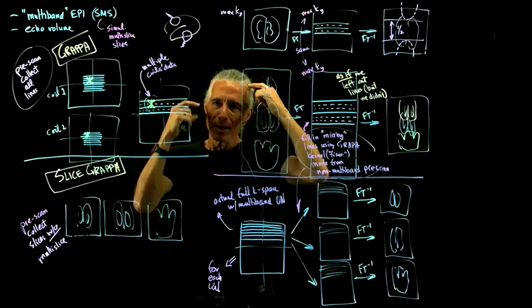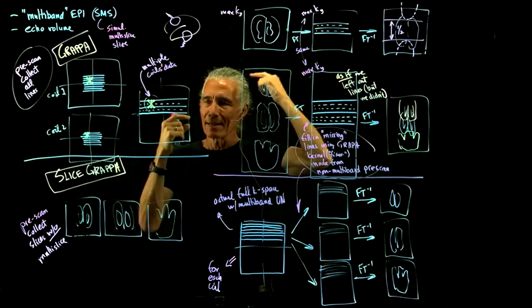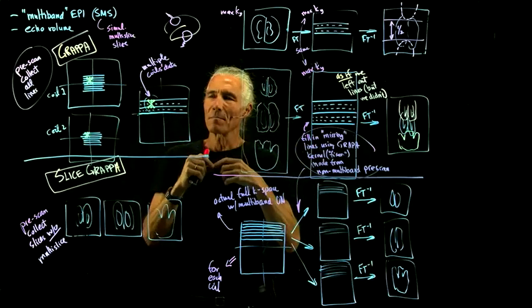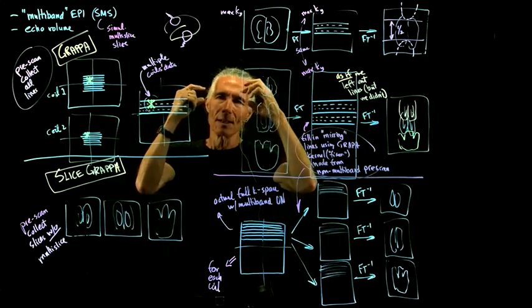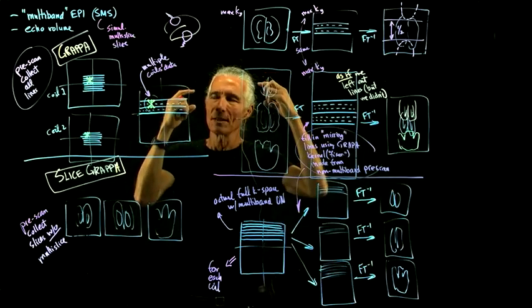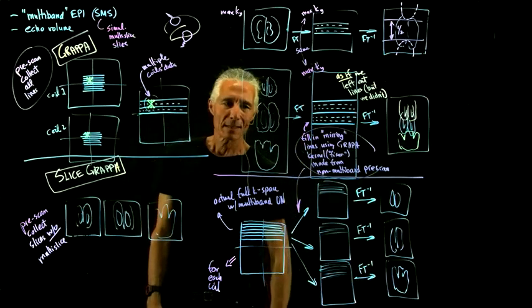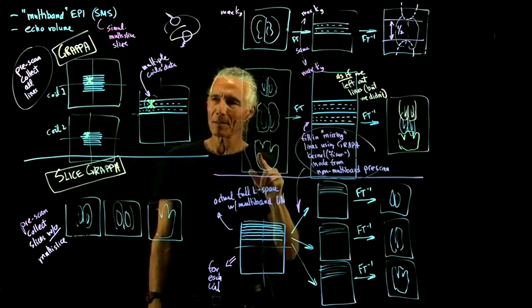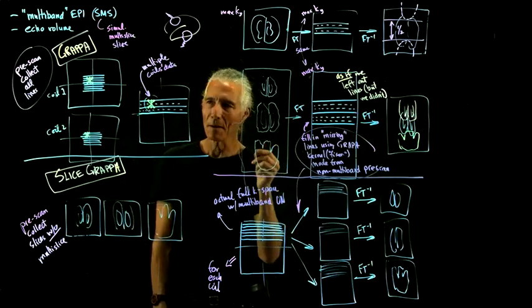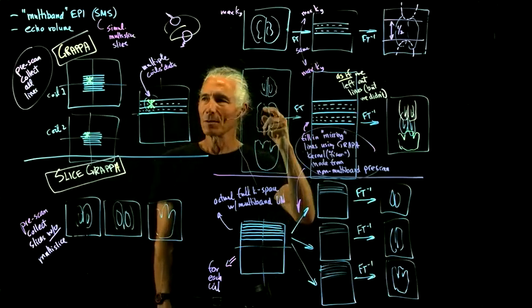Does the orbital frontal cortex go up when I see something? Or, if I'm preparing to make a movement, do several disparate parts of the brain start to go up? If you haven't perfectly un-overlapped the slices, that could seriously mess up that kind of data, because it will actually take some activation from one part of the brain and paste it onto another part.